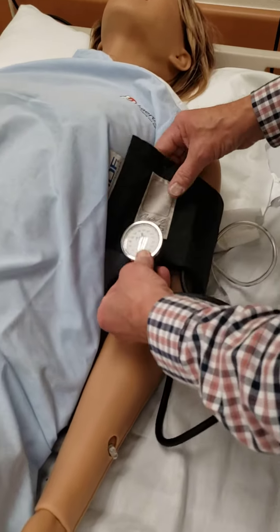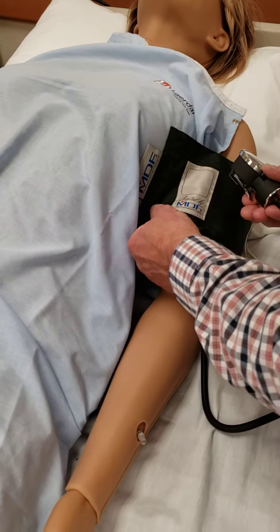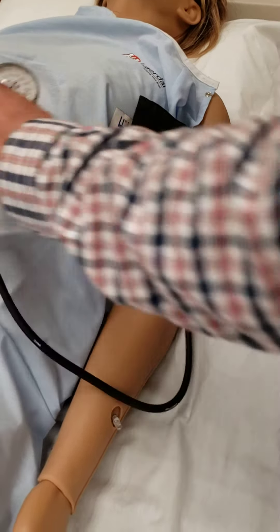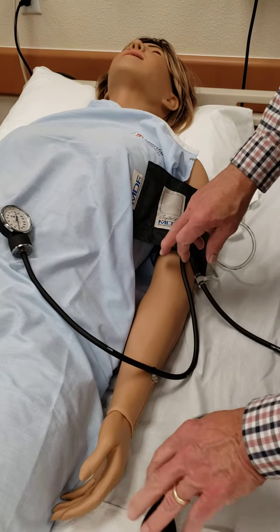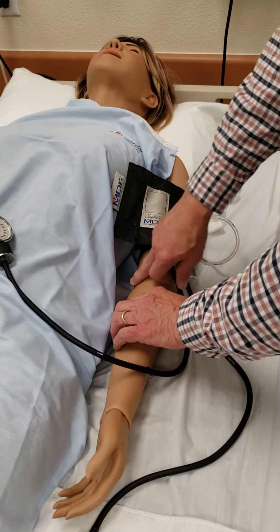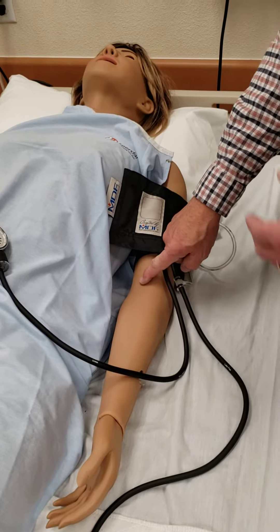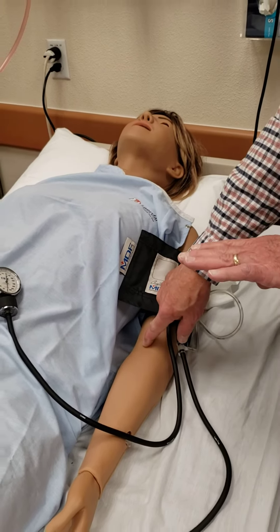Similar device, similar connections. You can just lay it there and do a blood pressure, or lay it on the belly if you want to do it that way — either way works. You're going to go to the same spot, typically in the antecubital, and put your stethoscope, because the speaker is typically down in this area. Just go ahead and do a manual blood pressure while the mannequin is on — you can't do it when it's off.